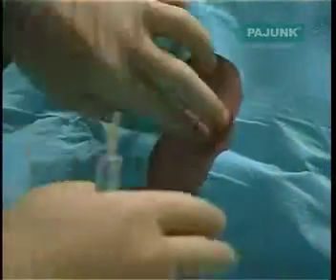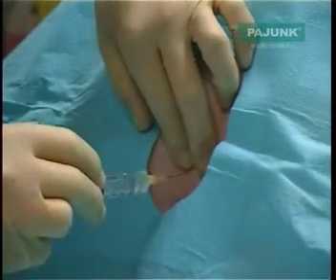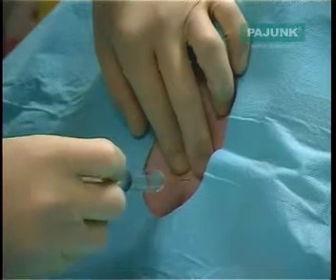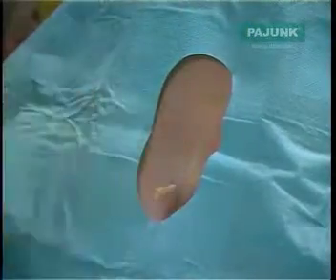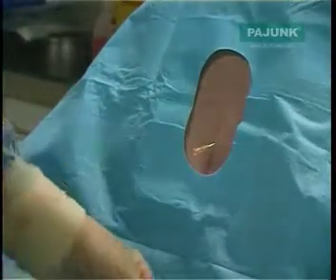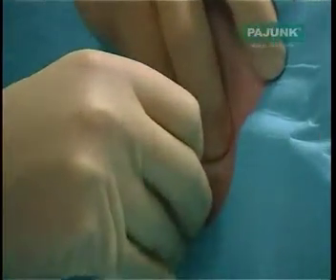This is a 64-year-old woman undergoing a total knee replacement. The skin has been prepped in the usual way and full aseptic precautions are being taken. The usual technique is used to identify the correct intervertebral space. First of all, the skin is anaesthetised with some local anaesthetic. At this point we use the stilette to make a small incision in the skin, to aid the passage of the atraumatic and therefore slightly blunt tip of the sprot needle.